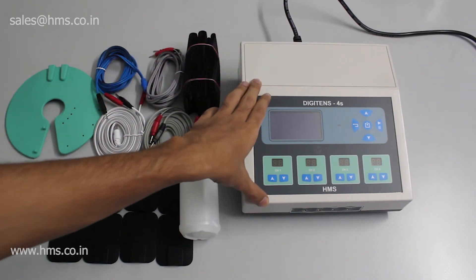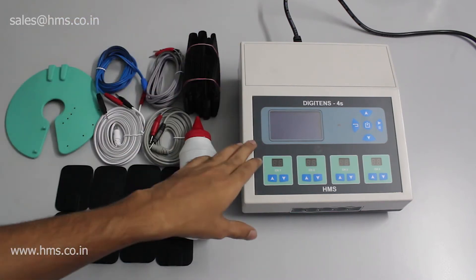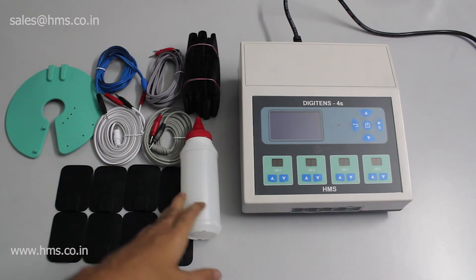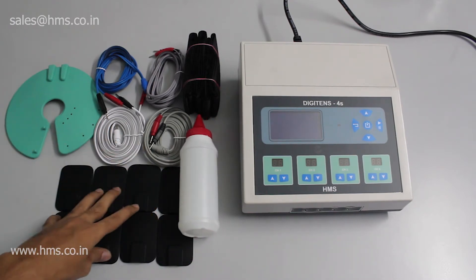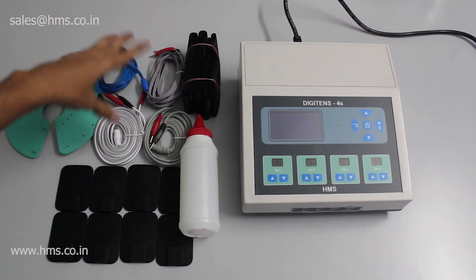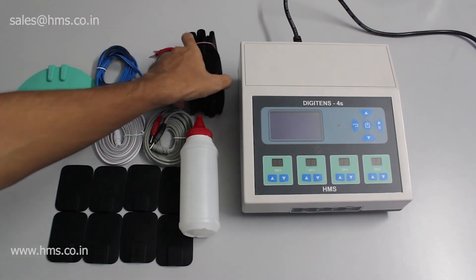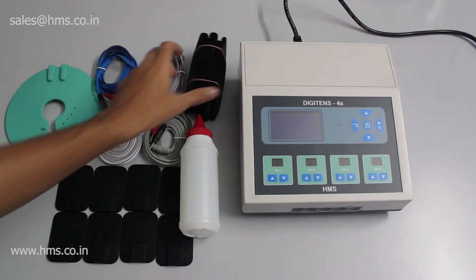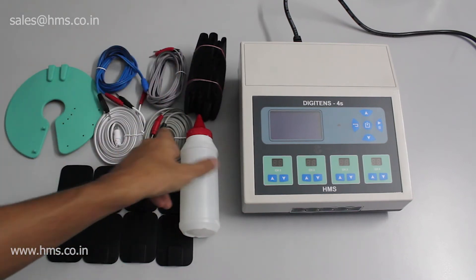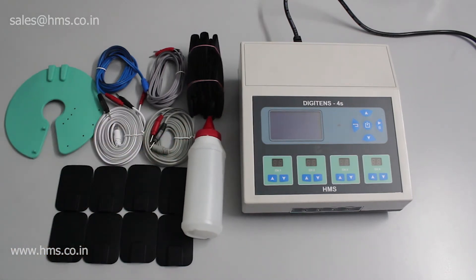Now let's look at the accessories that come along with the 4S out of the box. You'll get four pairs of electrodes, a breast electrode, four cables in different colors to differentiate between the channels during treatment, straps to hold the electrodes in place during treatment, and also a gel. These are the items included inside the box.